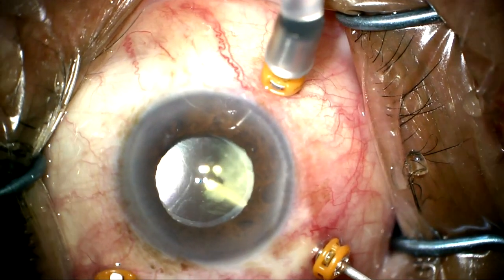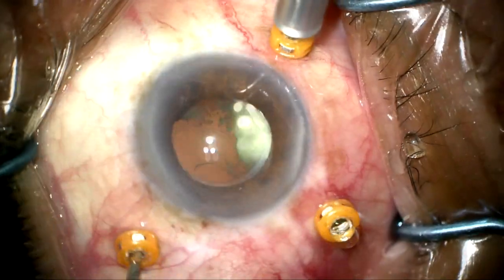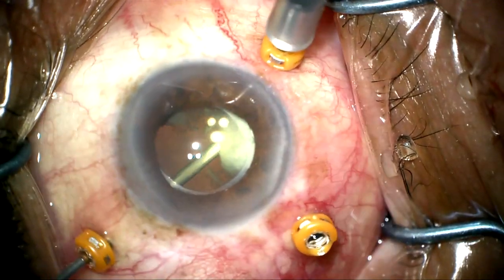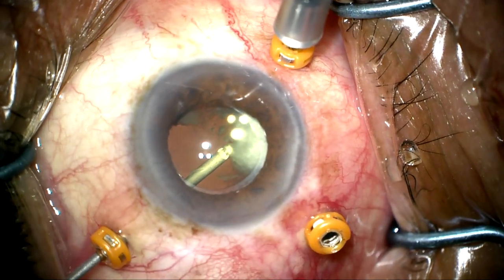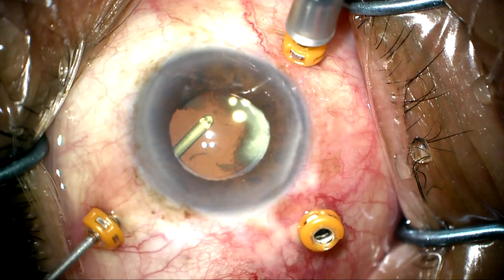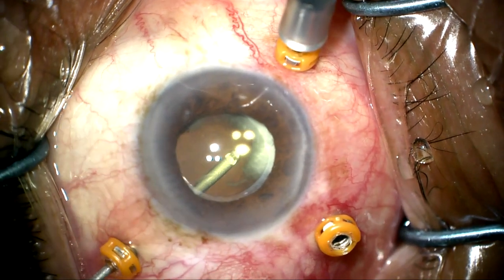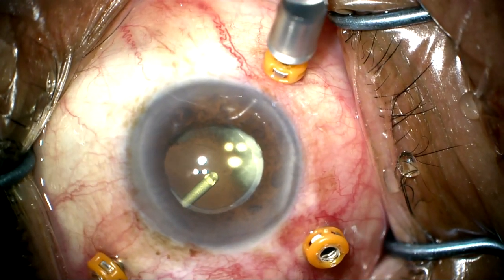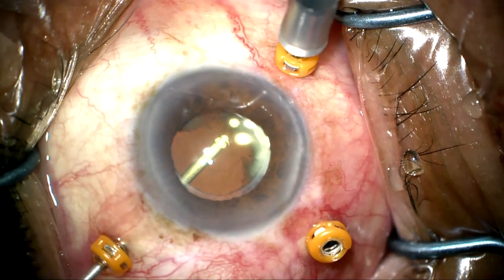Now I shut the cutter off and start vacuuming out the lens material, and I don't have to worry about engaging vitreous. I'm now going to come from the other side and push up on the lens a little bit with the vitrector so I can get in there and start vacuuming out some of this lens material with the cutter off. You can see that this sucks out of the capsular bag pretty nicely.